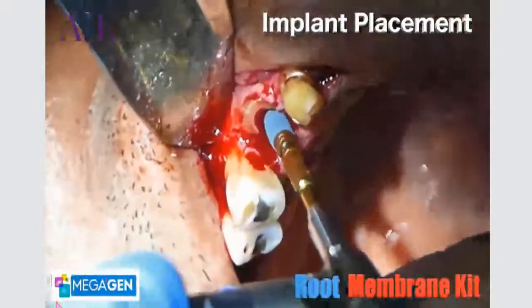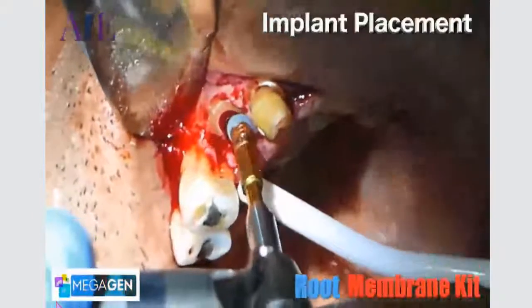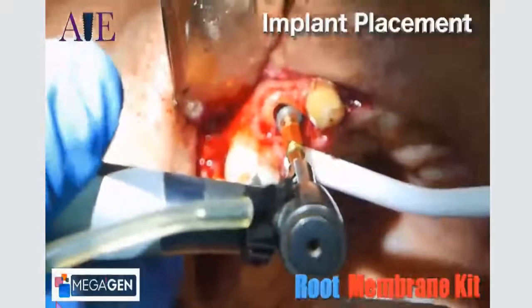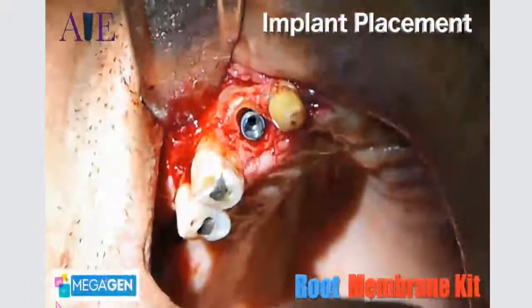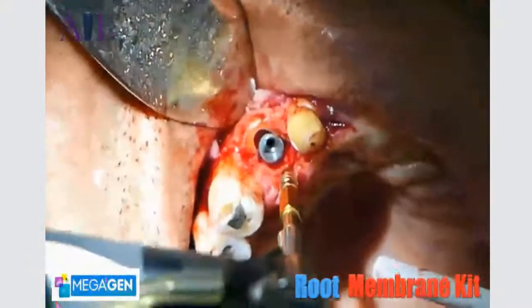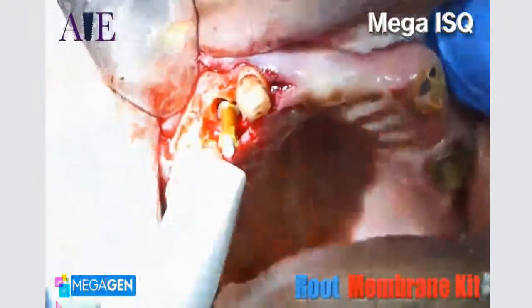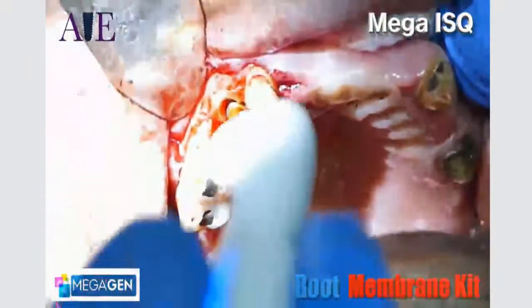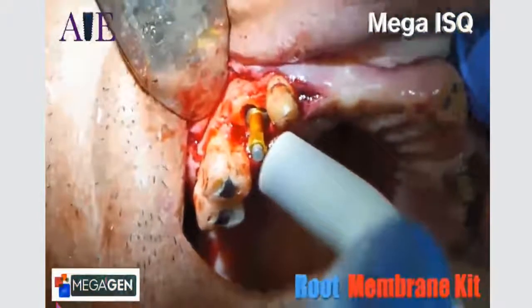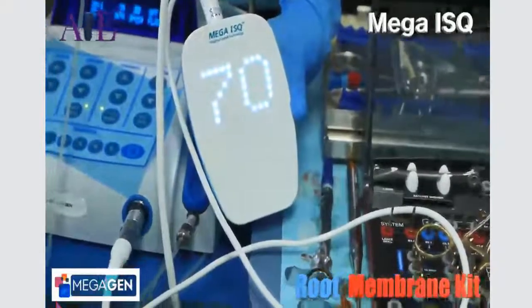to be able to take your diagnostic planning and execute that. So here you see the implant is going into place, and we're going to then, of course, measure the stability of this implant by using our implant stability quotient, resonance frequency analysis, and come up with an ISQ value. So it's very, very important that we start out with a proper diagnosis so that we know what we can do. And here you see an ISQ value, I believe, of 70 with the SmartPeg for this particular implant, which happens to be an AnyRidge implant. And we can visualize the stability on the Mega ISQ device that you see here.